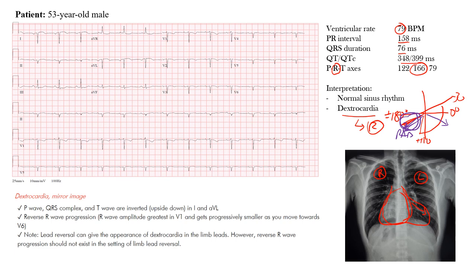In dextrocardia, the P wave, QRS complex, and T wave are inverted — upside down — in leads I and aVL. Normally those leads show upright P waves, QRS complexes, and T waves, but here they're all negative. In AVR, we'd normally expect negative P waves, but here they're upright and the QRS is also upright — you're seeing almost the opposite changes, which helps confirm sinus rhythm.